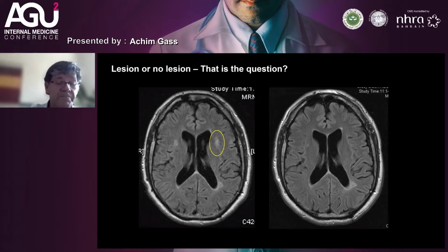If you want to speak to your radiologist next time, this is something you can use, where he will listen very carefully and say, oh, this neurologist knows quite a lot about MRI apparently, because when you ask, could this be a flow artifact, if you look at a lesion, then this will serve exactly this purpose.